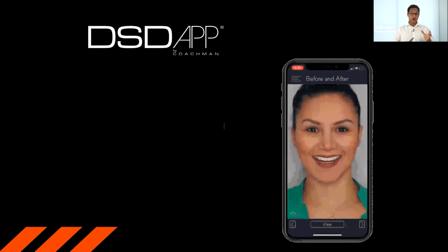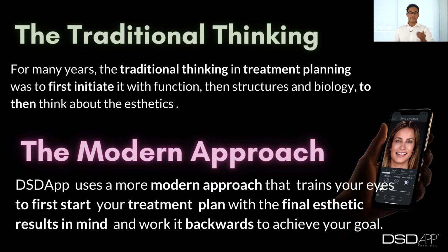So if we start thinking about the way that we treatment plan our patients, I can give you two different examples. One is the traditional thinking, which is a way of treatment planning your patients by first initiating function, then structures and biology, to then think about the aesthetics.